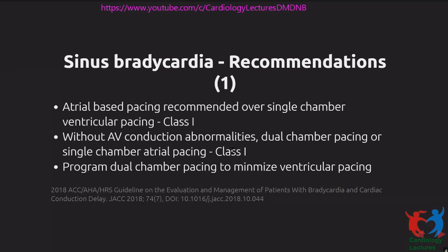So again, if you have patients with sinus bradycardia whom you're going to take up for pacing, two things I look at are their QRS width and their PR intervals if they have some conducted P waves. If their PR interval is normal and their QRS width is normal, it is fine to pace them single chamber. Many people practice looking at their Wenckebach block cycle length during implantation. We do it sometimes, but really there's no evidence to suggest that it has any value. Usually the Wenckebach block happens within the node, so it's really a marker of autonomic tone at that point, and where block happens in the node, it's not really going to predict future AV block. So going strictly by evidence, that should not carry any value.